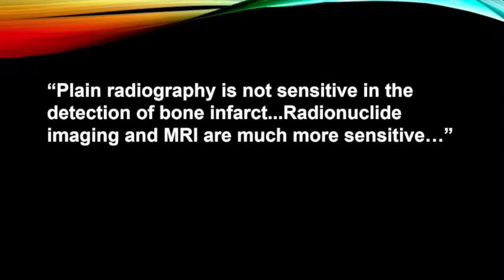Now, over the years, after Ratner first reported it, or if you go all the way to G.V. Black, sure, okay, but plain radiography wasn't sensitive for detecting it in bone, despite what you saw on Dr. Lechner's slides, which I thought were very impressive, and I was impressed with the lecture as well. Radionuclide imaging was the next thing to come along, but it was so sensitive that most people did it after they dug around for a bit and tried to cure the patient, and then they sent them for a scan. Well, of course it's going to be hot. They stirred up all that inflammation again, okay?